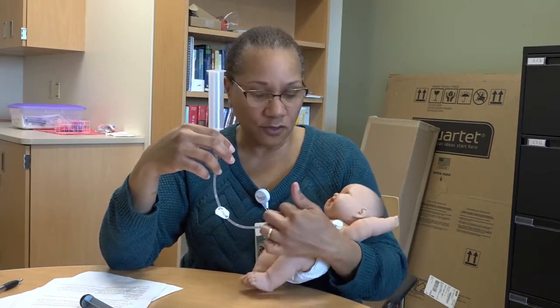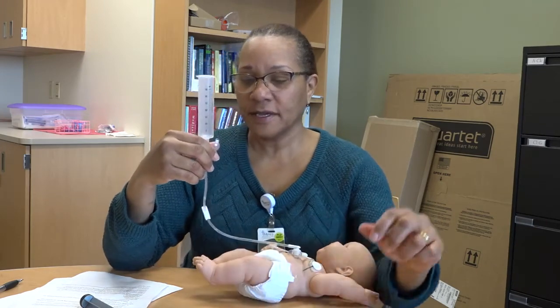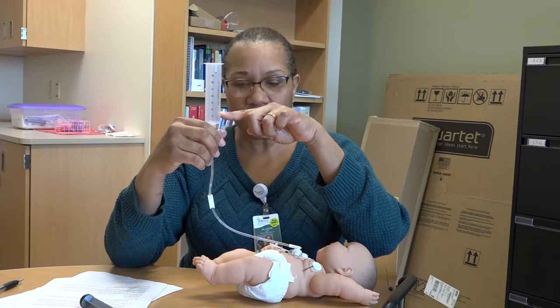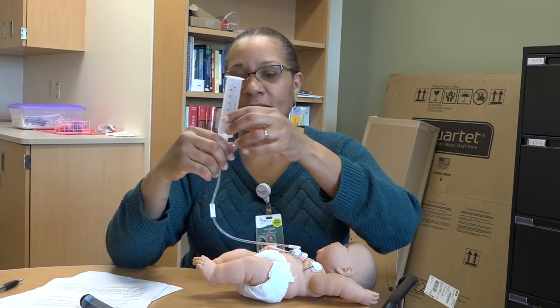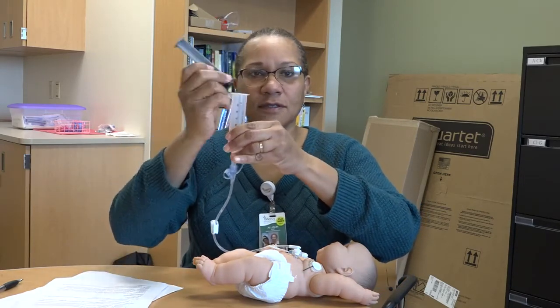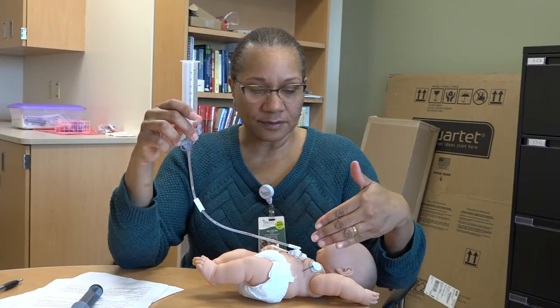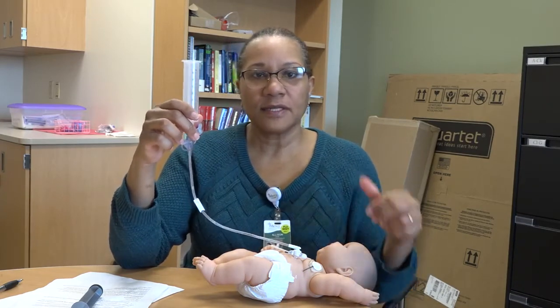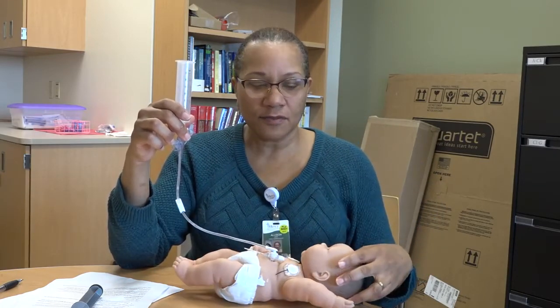So make sure this is closed, and you can hold this while you have your baby upright. You can hold this up, and so formula and sometimes bubbling, you might even hear some air bubble, come up into your syringe, and you can bubble them for about 10-15 minutes. And then after that, if formula has rolled back up into the syringe, usually by that time it equalizes and it kind of rolls back down by itself. Sometimes it may not roll back down by itself, and you just give a little push with your syringe. After the 10 or 15 minutes, the formula goes back down, and don't forget to flush after that. But that's decompression, burping, venting, all mean the same thing. You're just trying to get air bubbles from the baby's tummy.